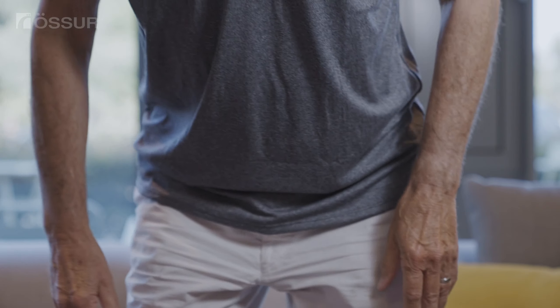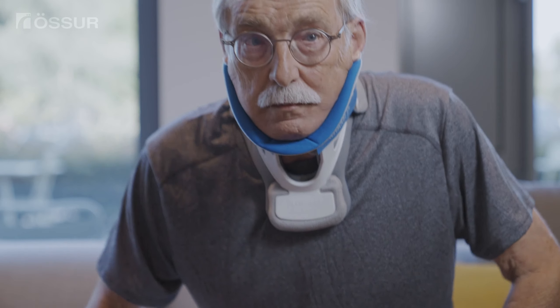Sit or stand in front of a mirror. Undo the strap on one side of the collar while supporting the front with the other hand. Carefully remove the collar.